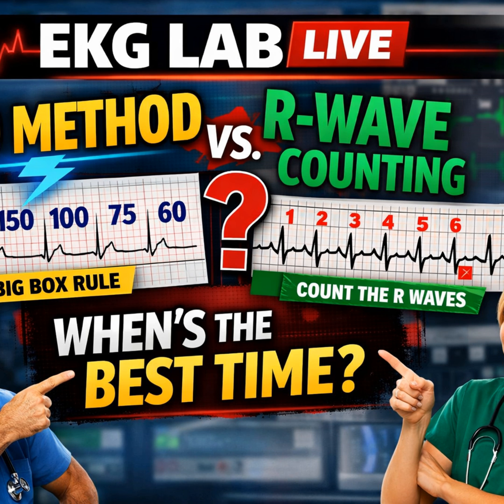Lies is a little dramatic. Is it? I think it's accurate. The heart rate, in a physiological sense, is how many times the ventricle pumps per minute. That's what determines cardiac output. The strip method, counting every R wave across 6 seconds and multiplying by 10, gives you the average. It smooths out the chaos. It gives you the hemodynamic truth of what that patient is experiencing, not some mathematical projection based on 2 random beats.